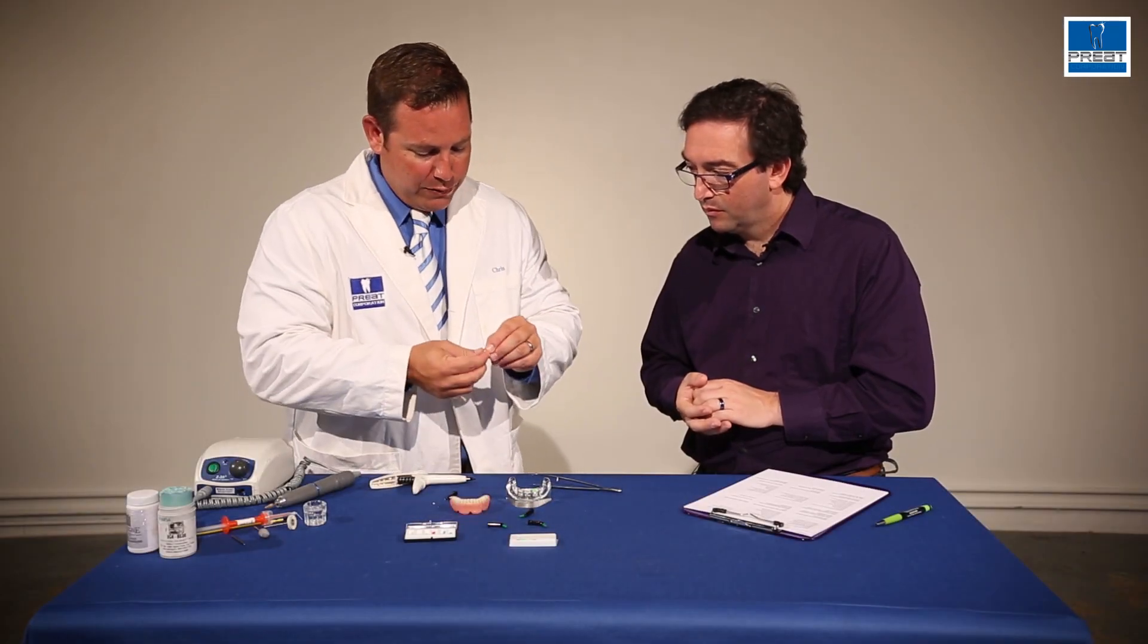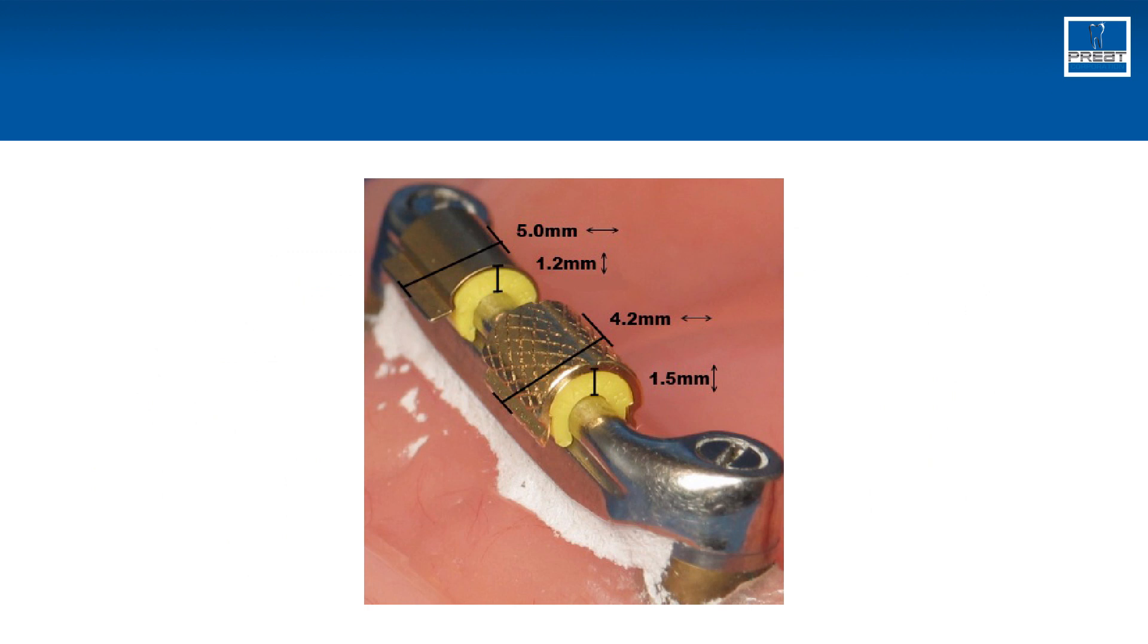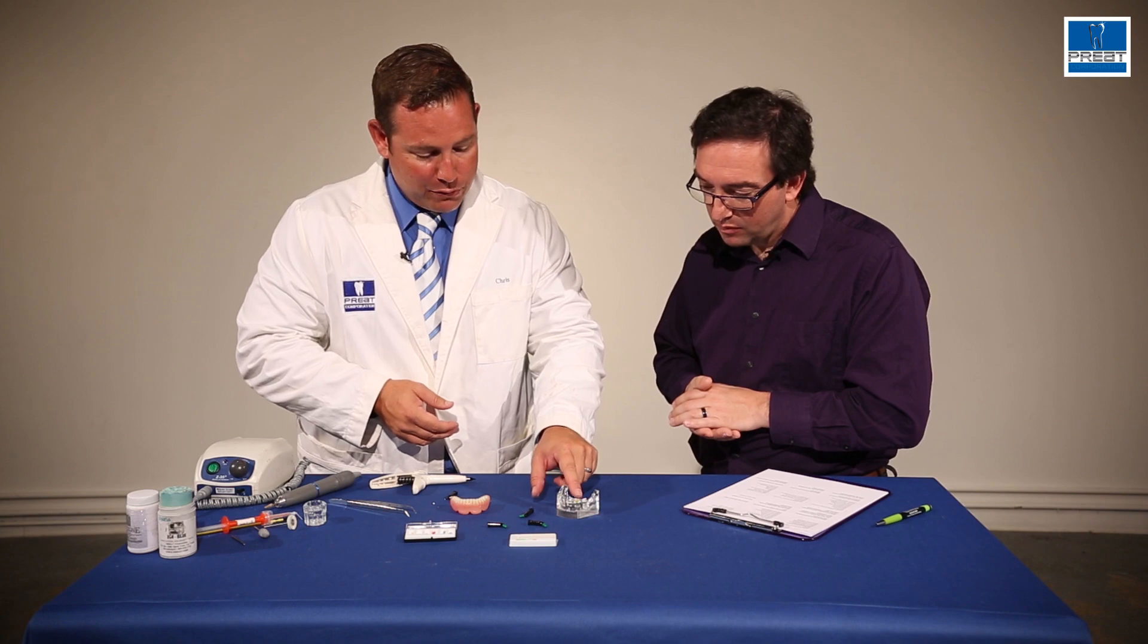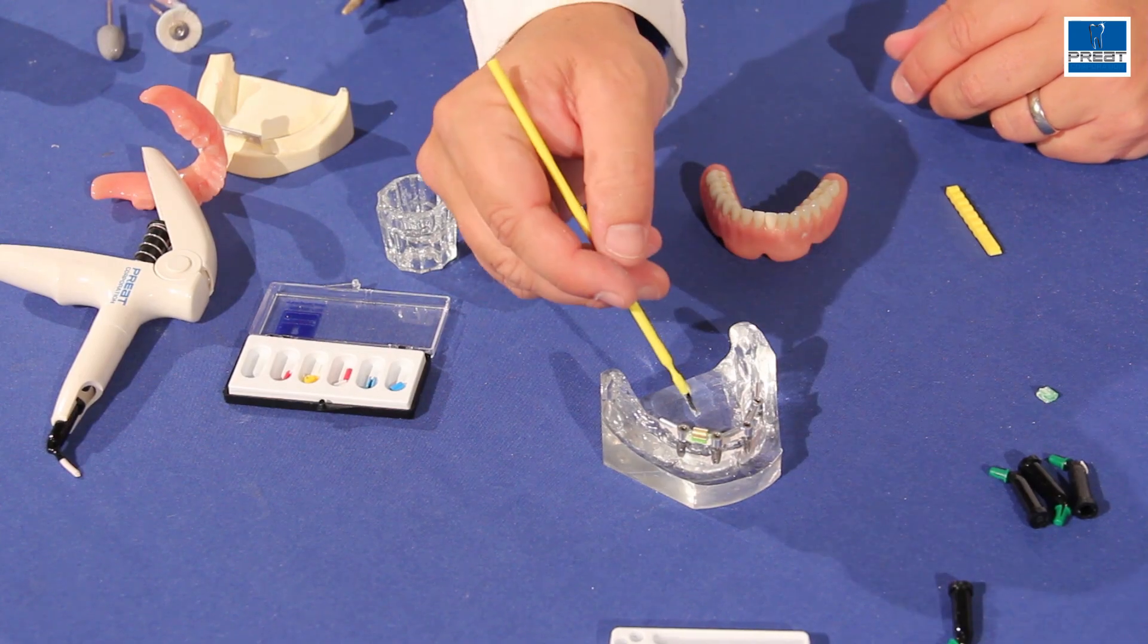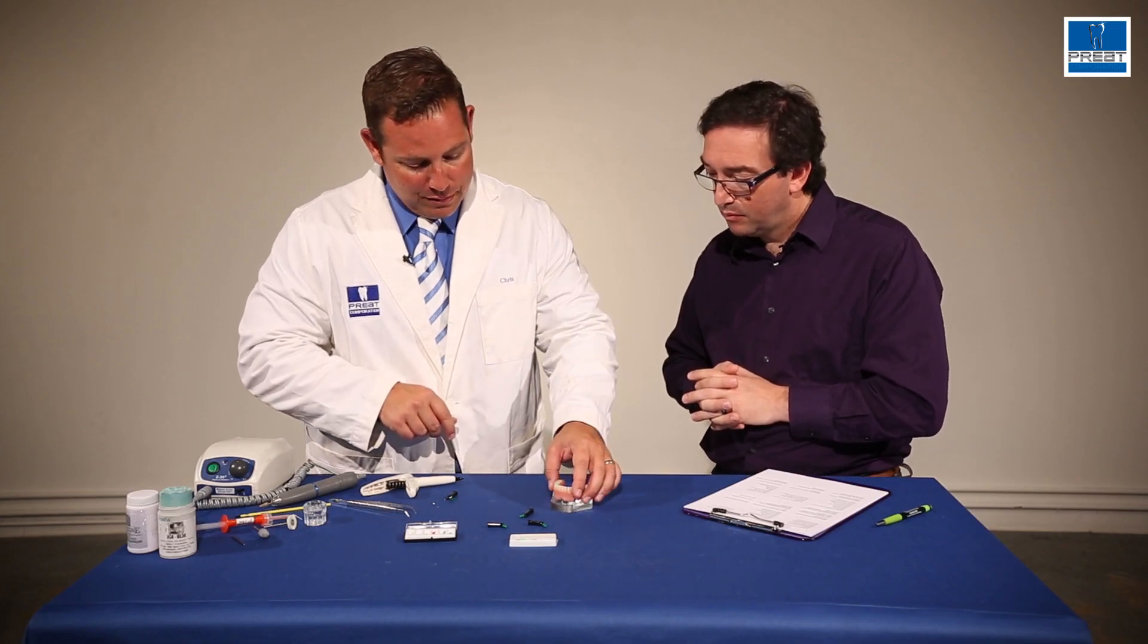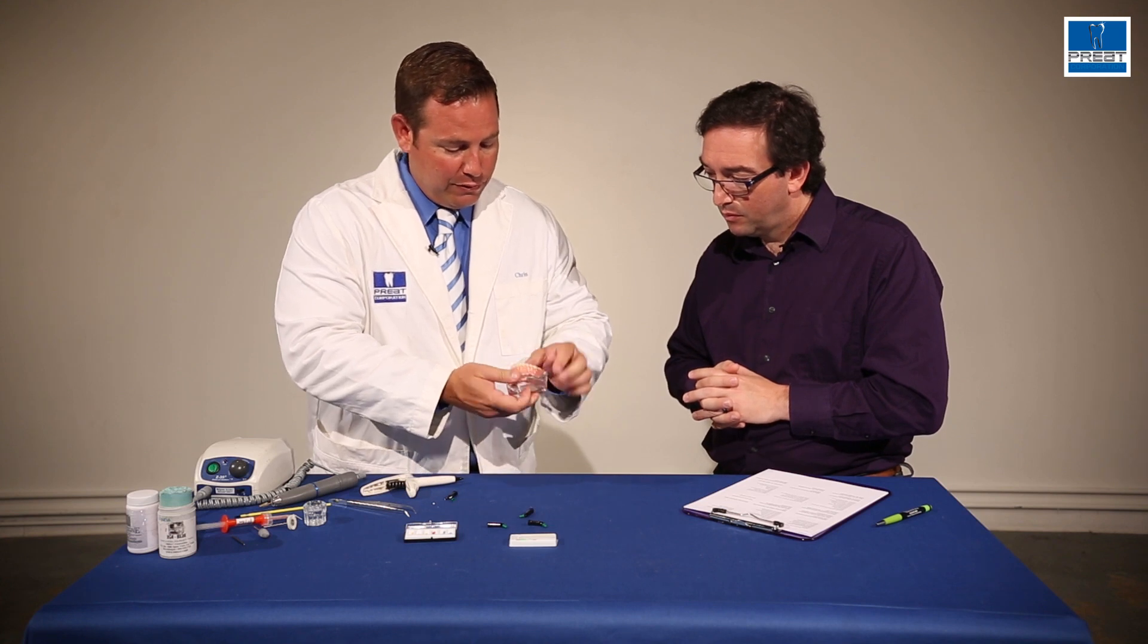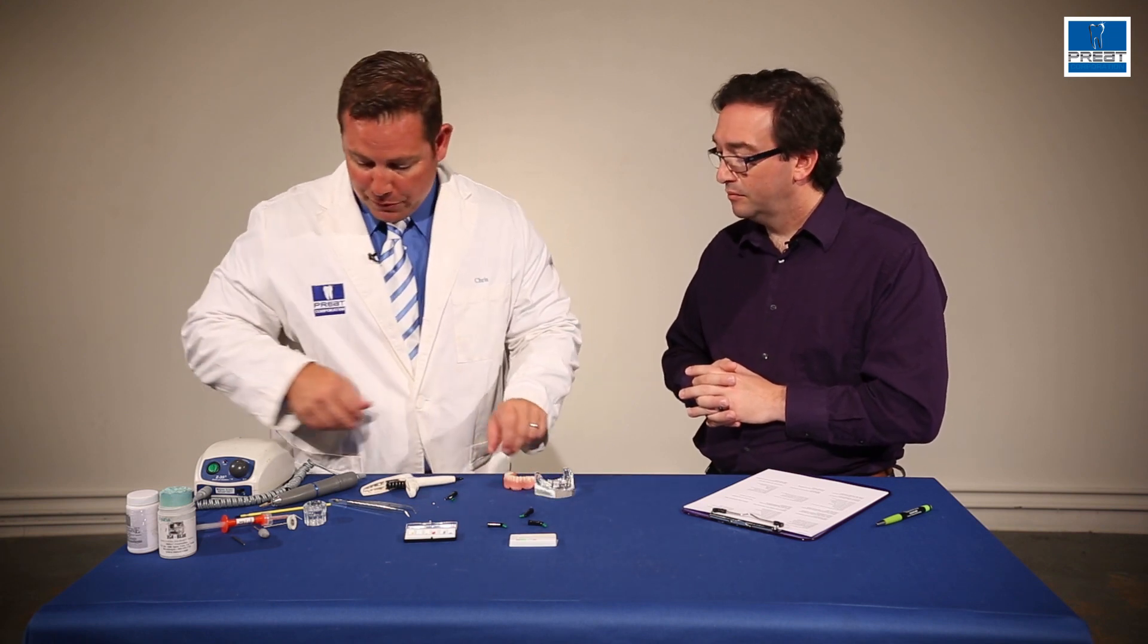Next thing I'm going to do is I'm going to take a housing. We have two different styles of the metal housings. One has longer wings. So now that I have the housing on top of the green processing clip, I have my blockout done. To chemically activate the top of that housing and get a better cure, I'm just going to paint a little bit of monomer on top of the housing. And the monomer is going to activate. While I let that dry, what I'm going to do is I'm going to seat my prosthesis down, make sure it can seat, there's no premature contact.